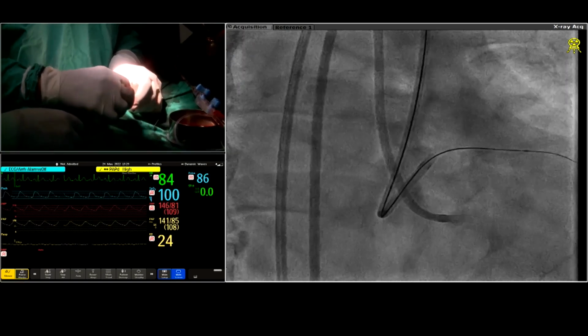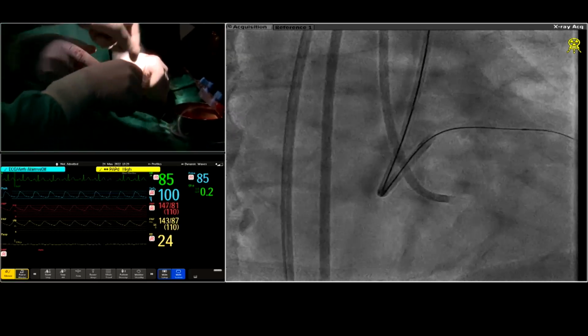It has reached here. टर्क यहाँ लगाएंगे, हाँ.